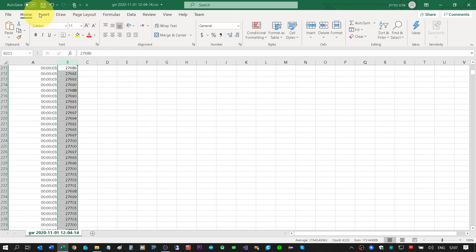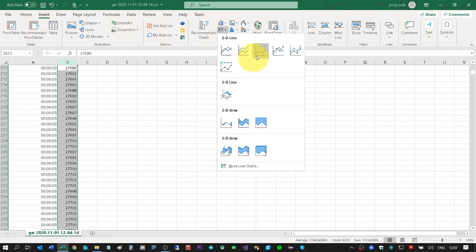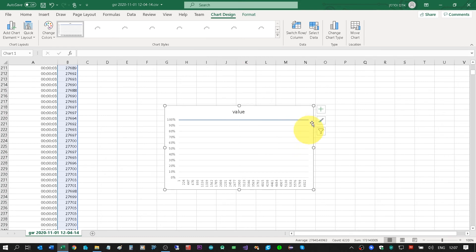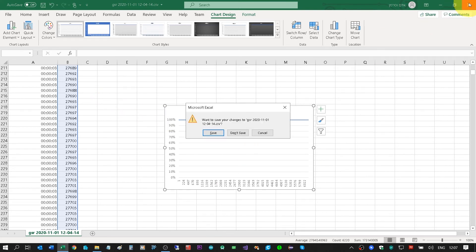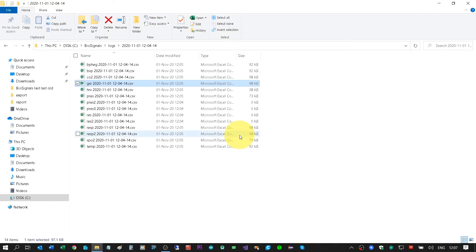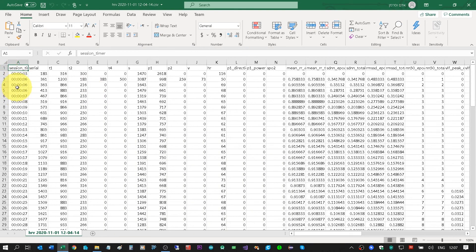Let's go through them one by one. Double clicking on the GSR file opens it in Excel. We can see two columns: the left one is the timer — 60 rows per second, because the reading speed is 60 per second — and the right column is the signal data from the GSR. The HRV file is different because it is not 60 rows per second — each new row is a new heart rate.